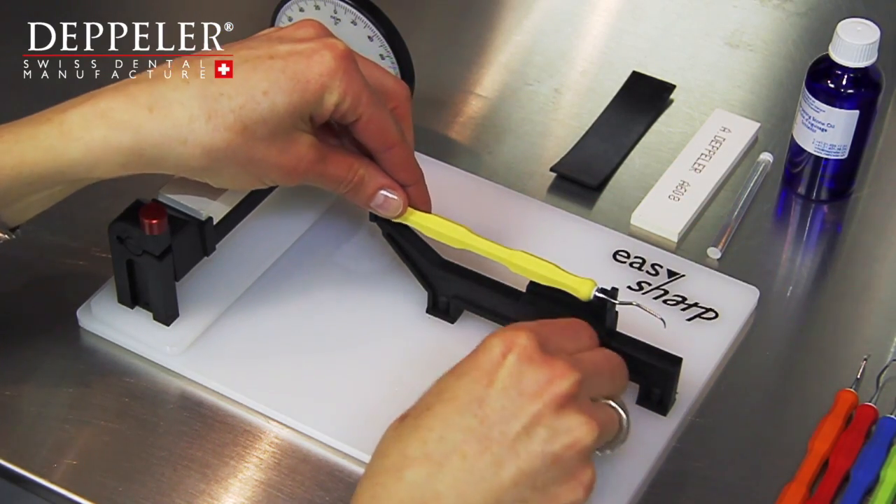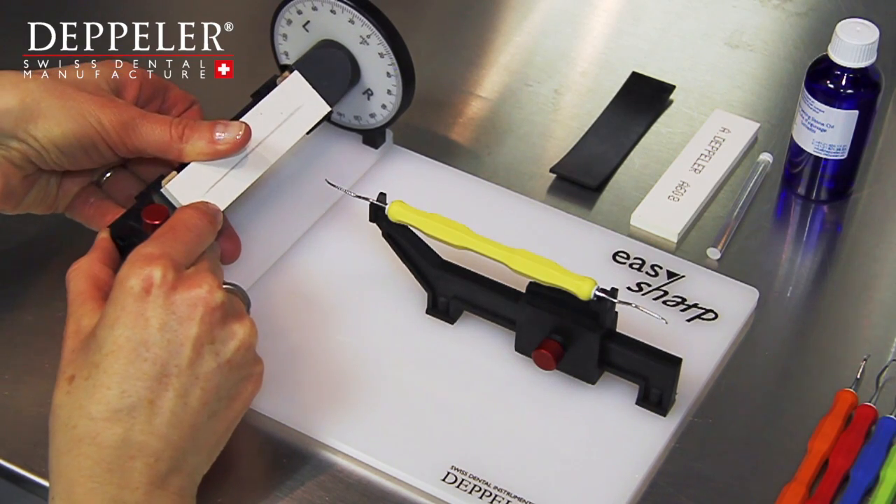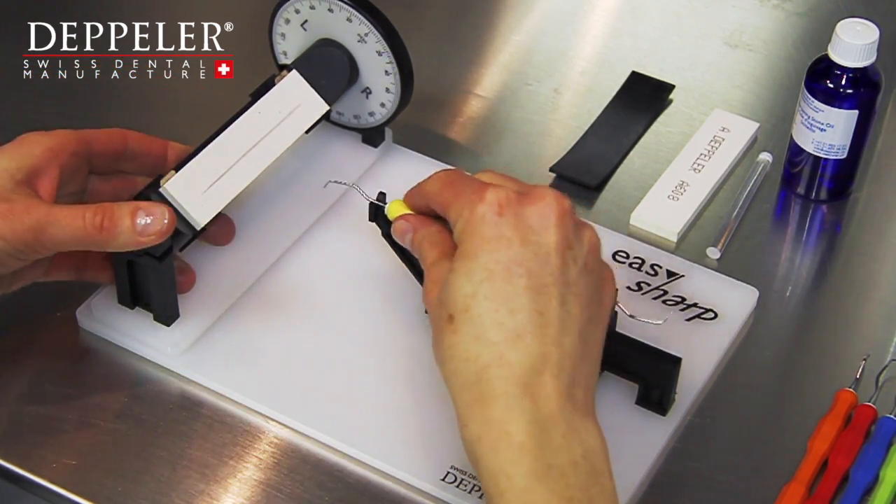To save time, sort your instruments by item number and sharpen the same instrument one after the other to avoid having to adjust the angles too often.